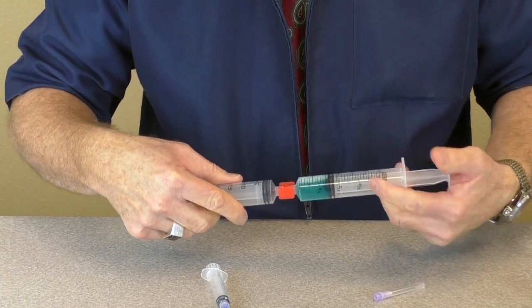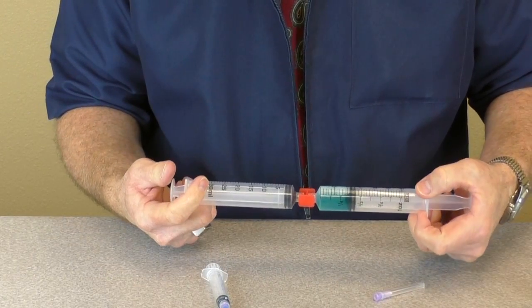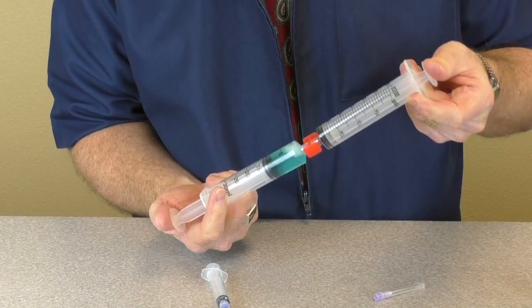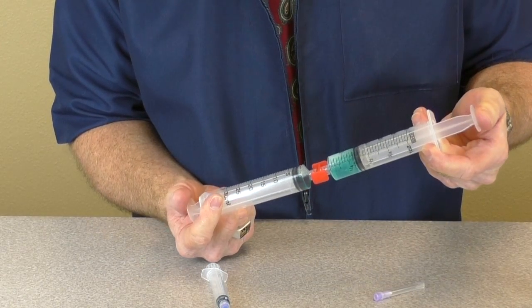Gently push the contents of one syringe into the other. Repeat this 15 times, pushing all of this new mixture finally into one syringe.